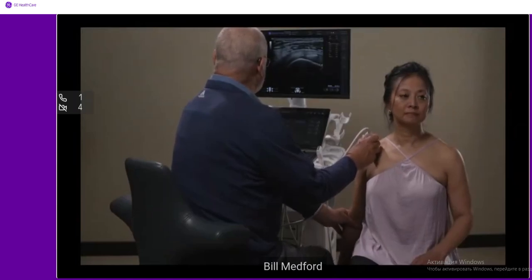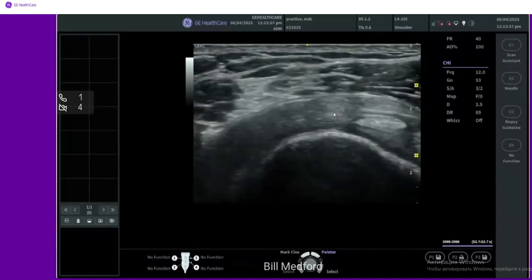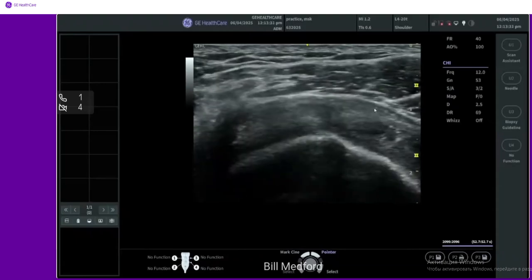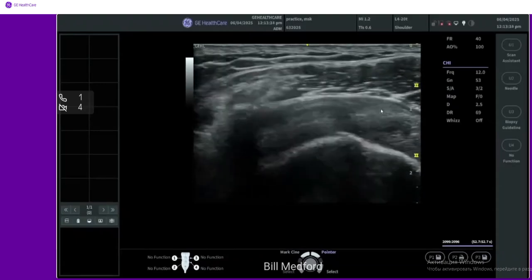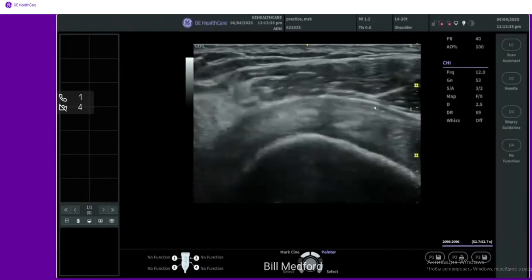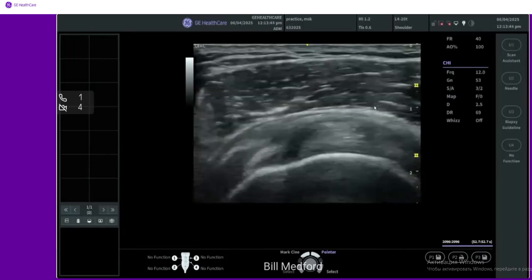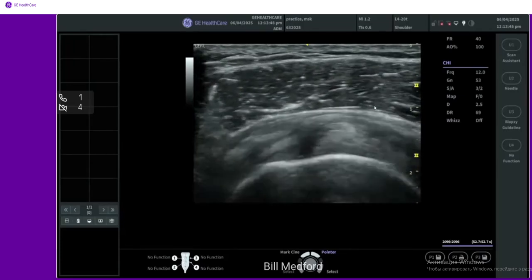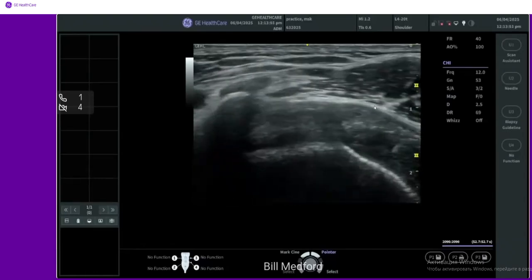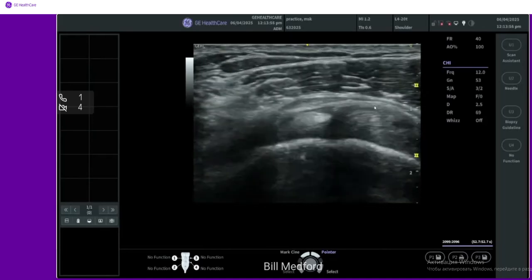Also, I like this dynamic maneuver when you have a suspected bursal defect, because you can see the bursa sliding on the underside of the deltoid muscle with that dynamic motion of just rotating the full arm. So if there's a little bit of dipping of tissue into a bursal-sided defect, you might recognize it by doing this internal-external rotation maneuver and observing the bursa there as well.